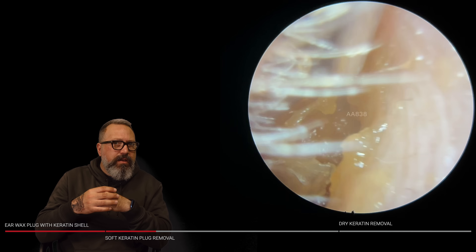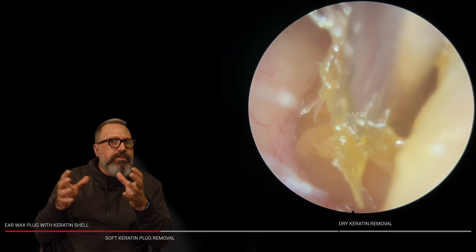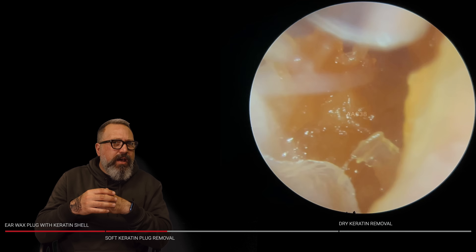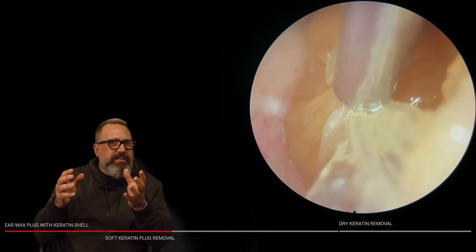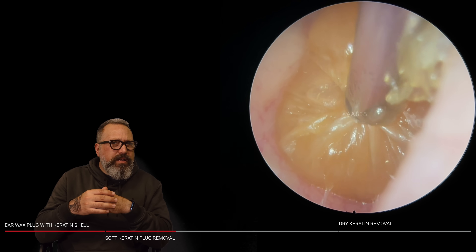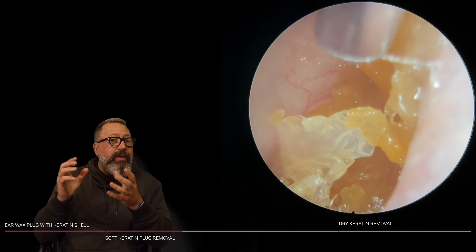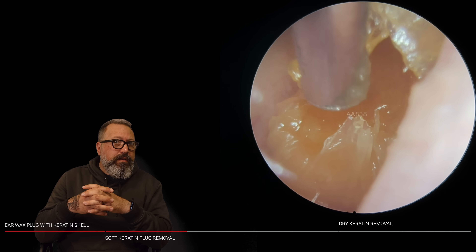Another very soft section there. Just going to lift this — I'm trying to bunch as much of this keratin into the suction tube as we can. That leaves less room for any clarinetting at the end of the suction. This is a weird consistency — we've got this sort of dry skin layer and then this kind of soupy wax consistency in the middle. It wouldn't surprise me if the patient used a little bit of bicarb in here. Bicarb or peroxide does tend to have a bleaching effect on the wax, so the wax becomes much lighter in colour, which is what you can see here, or in some cases can go white.